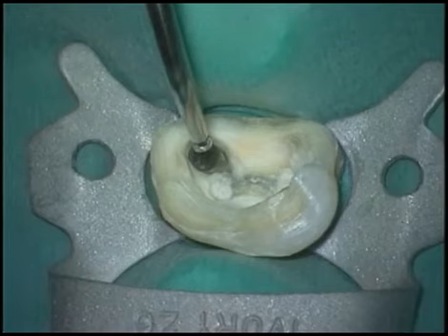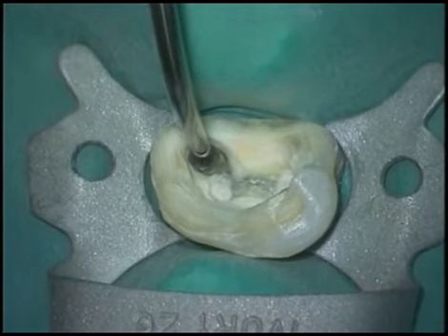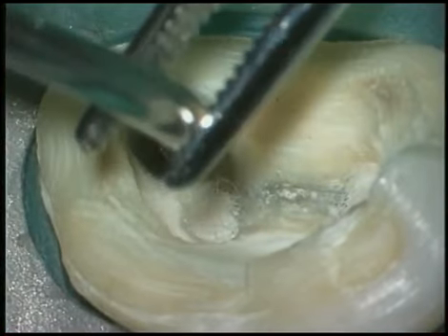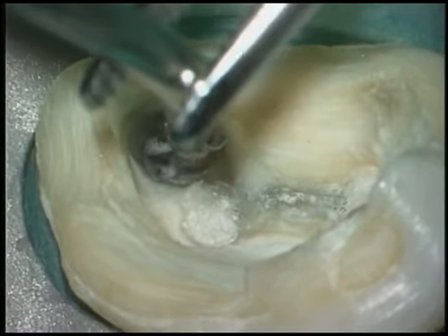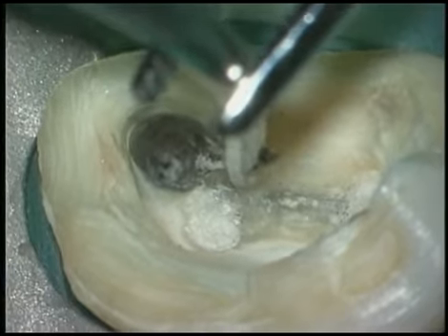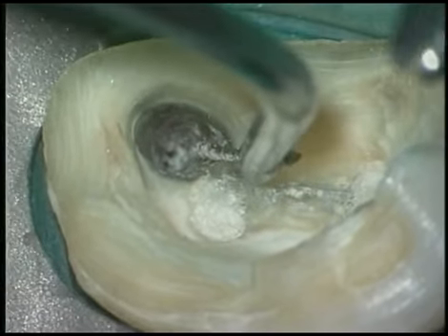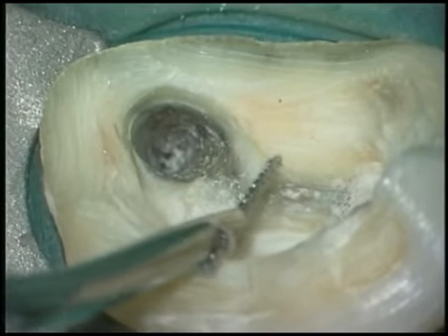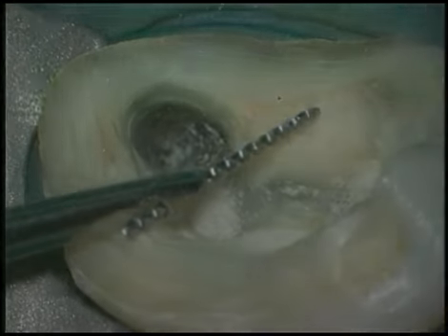In this instance, then we use the instrument removal system. This is a prototype. It's placed into the canal and is pushed firmly to place. This will kick the head of the file out through the cutout window, and you can see this provides an enormous mechanical advantage and success in removing broken files.